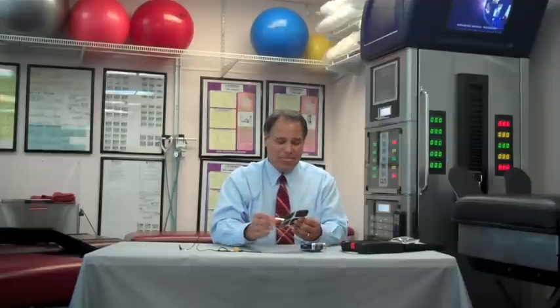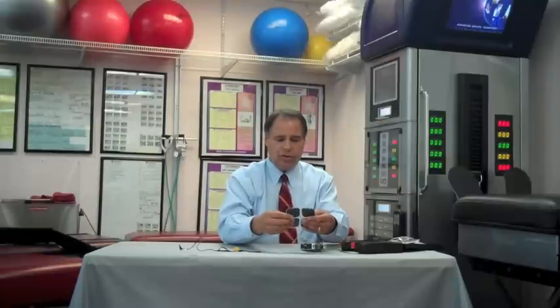Let's hook up the device. I have electrodes here. These are self-sticking electrodes. You would want to keep these electrodes in the package to keep them from drying out. In addition, you'll notice that they're on a protective plastic sheet. It's important to keep them on that sheet when you're not in use.